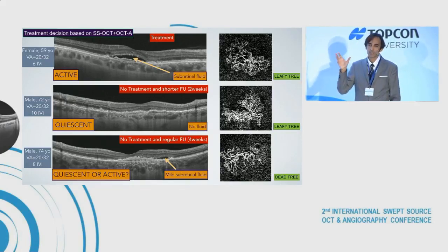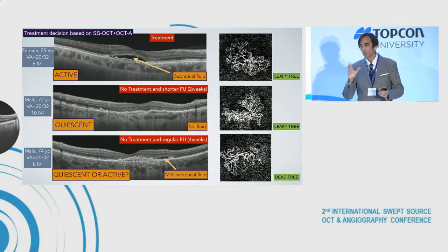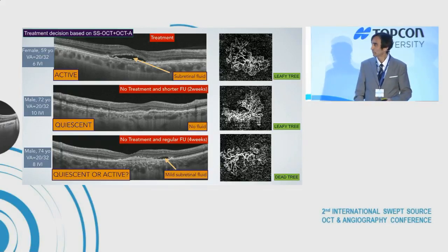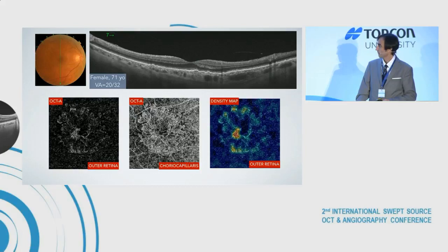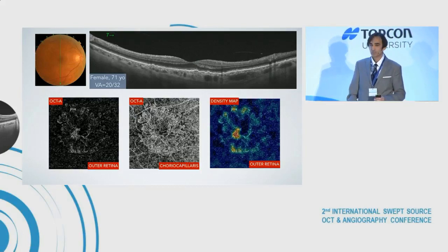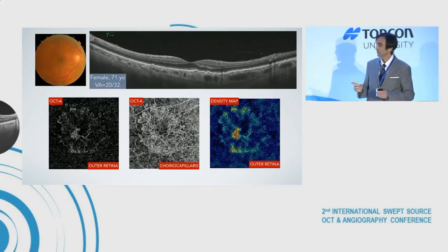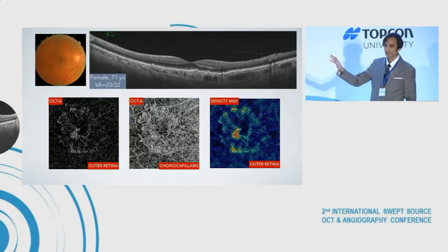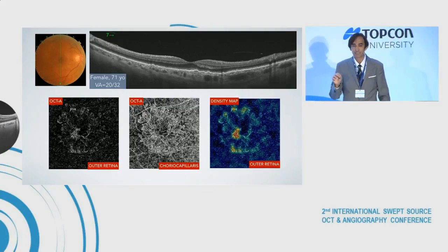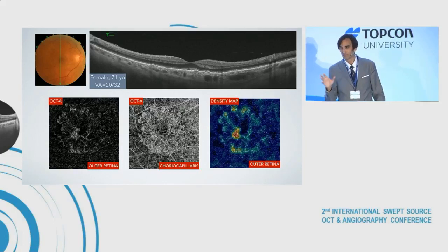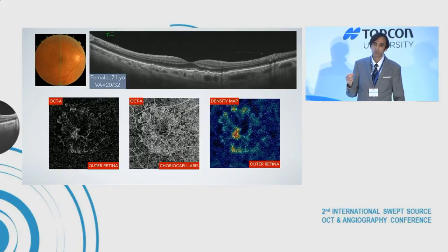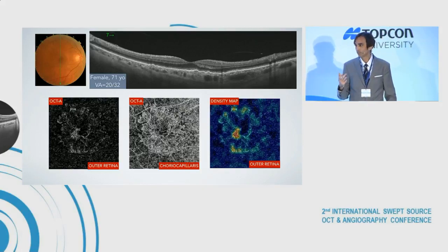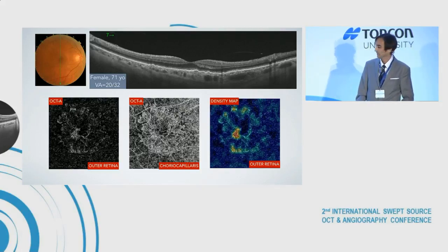You can see that with the additional information provided by OCT angiography, we can change our mind when deciding whether or not to treat patients. On the other hand, it's important to know that OCT angiography can show very clear neovascular complexes in the absence of macular fluid at any time. Therefore, the term 'neovascular' appears to be more convenient than 'wet' or 'exudative' to name this disease.